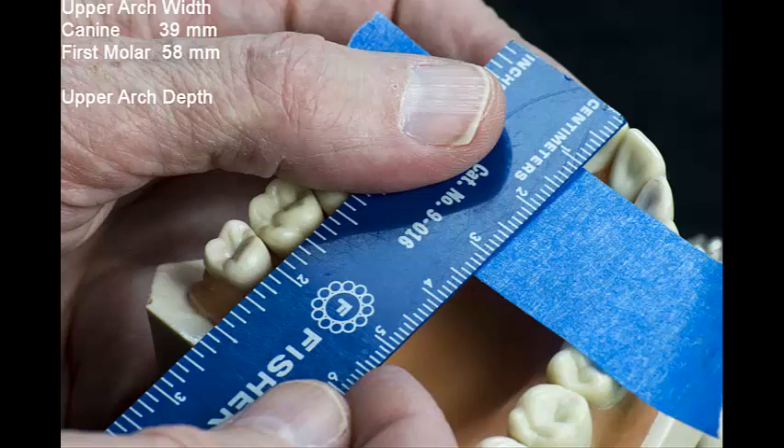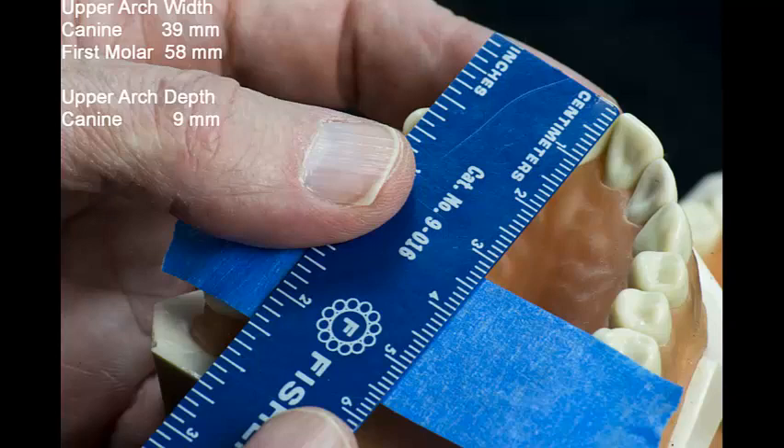Next, aligning my ruler with both the central incisor contact point and the center width mark, I measure an arch depth of 9 millimeters. Repeating this procedure for the first molars, the arch depth is 33 millimeters.